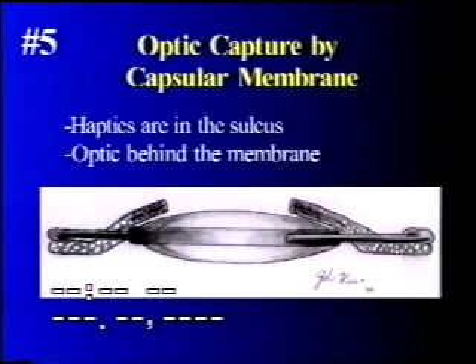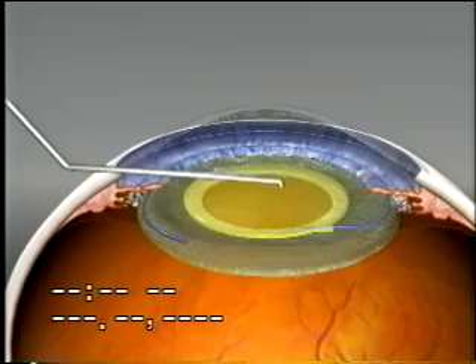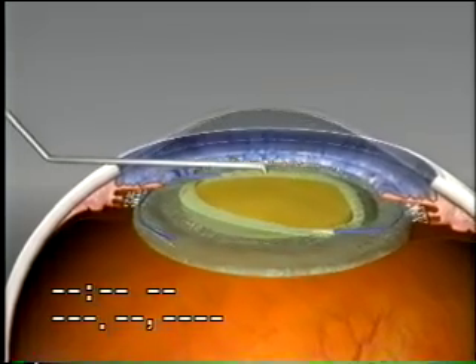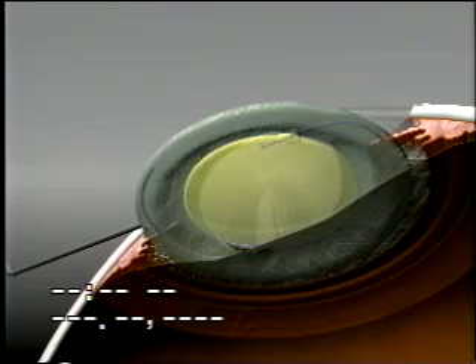The fifth option is optic capture by a capsular membrane. Here the haptics are in the sulcus and the optic is pushed through the opening in the membrane to obtain fixation. The membrane opening must be slightly smaller than the optic diameter. The opening in these membranes is usually resistant to tearing because of the fibrous metaplasia that forms a fibrous ring around the opening.